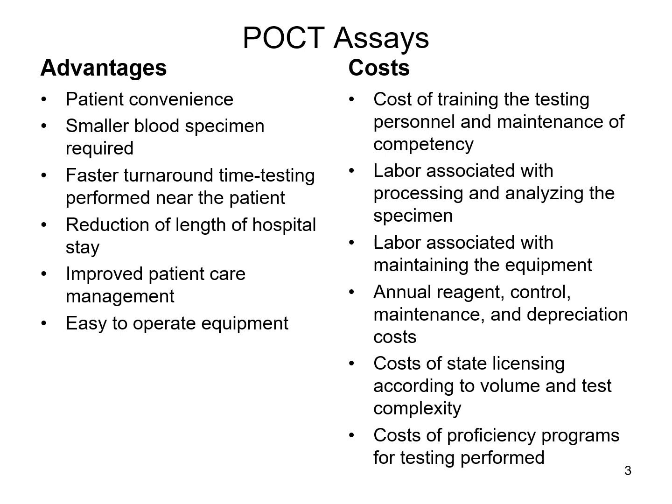Now there are costs associated with point of care testing. And that would include training and maintenance of the machines, keeping up that competency, any sort of labor costs associated with processing and analyzing those samples, and maintaining that equipment, doing those checks. Just like any testing within the lab, point of care testing does require quality control, making sure that any kind of analyzer that may be associated with it, that you keep up with the regulations and what they state for those particular analyzers.